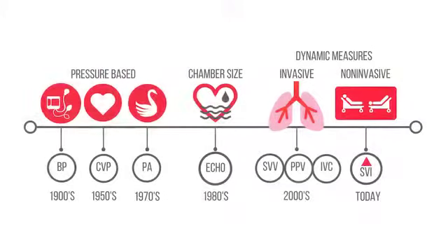In the early 2000s, a lot of work was done using respiratory-based loading of the heart to assess fluid responsiveness. So we have our pulse pressure variation and our stroke volume variation, often utilizing pulse contour technologies. Those rely on changes in the respiratory cycle to load the heart. This actually works very well, but it's very difficult to implement in clinical practice because it requires our patient to be intubated. They have to have a stable rhythm. They need to be paralyzed, and that makes it really difficult to implement on our patients.